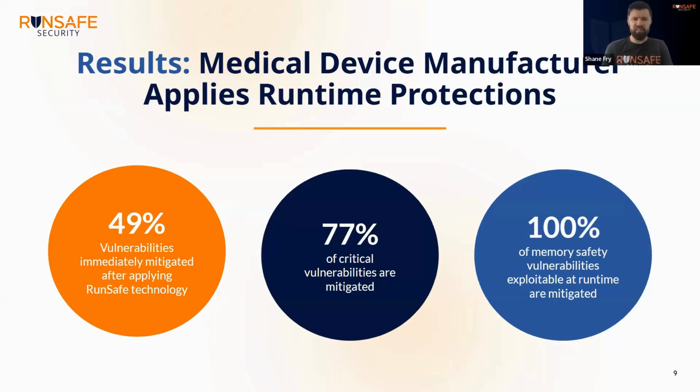But from a security perspective, we see, like you said, about 70% of all the embedded device vulnerabilities are memory safety related. So that's buffer overflows, heap use after free. And one of the things that's really interesting about that is the majority of them are high or critical CVSS scores, whether you use V2, V3, V4, they tend to be in the high critical range. But if you dig a little deeper into how long it takes for those vulnerabilities to be patched, a SQL injection bug can usually be patched in a day. Sometimes even shorter than that. But the mean time to remediate a buffer overflow in embedded devices is like 180 days. And so that's 6 months of knowing about a vulnerability before we get a patch out.